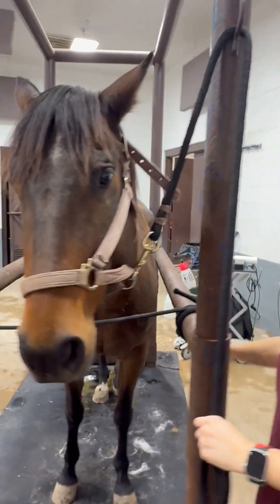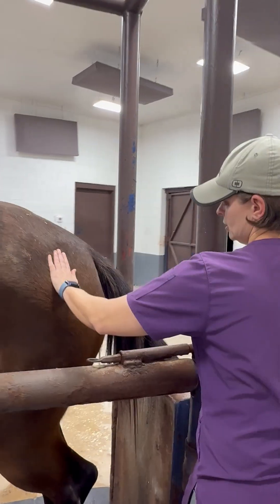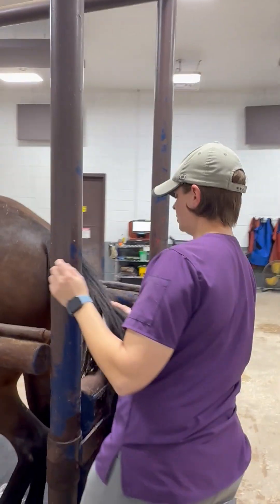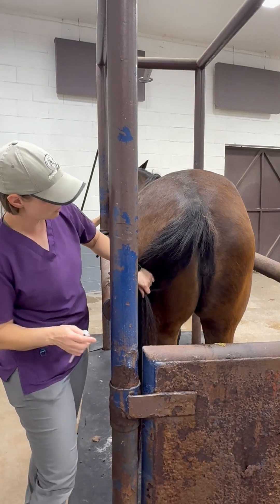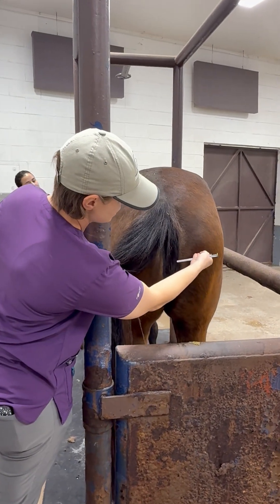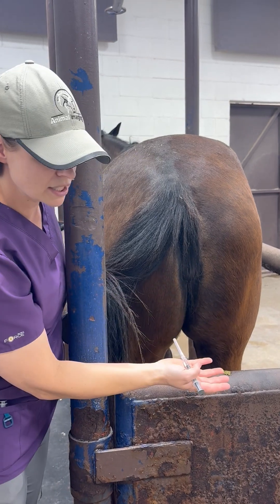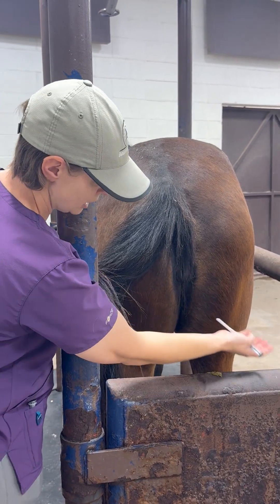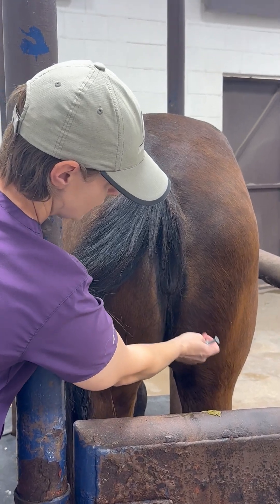The third spot you can give an injection is in the butt. If you're out in the field, it can be a little more dangerous because they can kick, but most horses do tolerate it okay. The pelvis is up here, so you want to come below that. If this site does get infected, gravity will pull any infection out. So you want to come right down here into the nice big thick muscle.